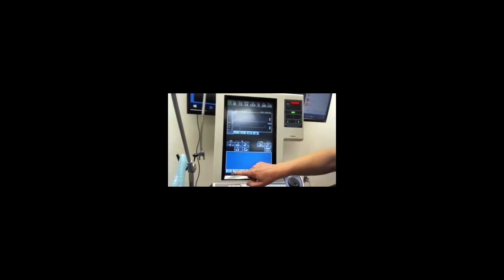You want to know about pressure control or pressure support? Pressure support. All right, so I'll show you how to do it. Could we keep the screen close up? You would go into the setup, hit the mode that you want to change and bring it down to SIMV, and you would hit accept or continue and then accept, and it switches it to the SIMV mode.